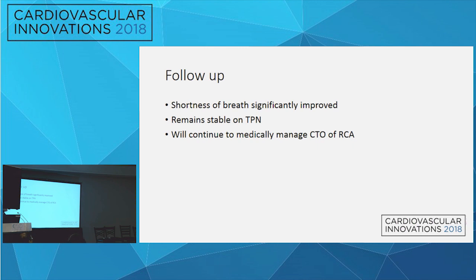Good planning. What size would you cut off for that Impella? Probably about 5, 5 and a half. That's what we've generally been using. If there's a LIMA, or CP, yeah. When there's a LIMA there, I like at least a millimeter, or a millimeter and a half or 2 millimeters greater than the sheath size. All right, thank you.